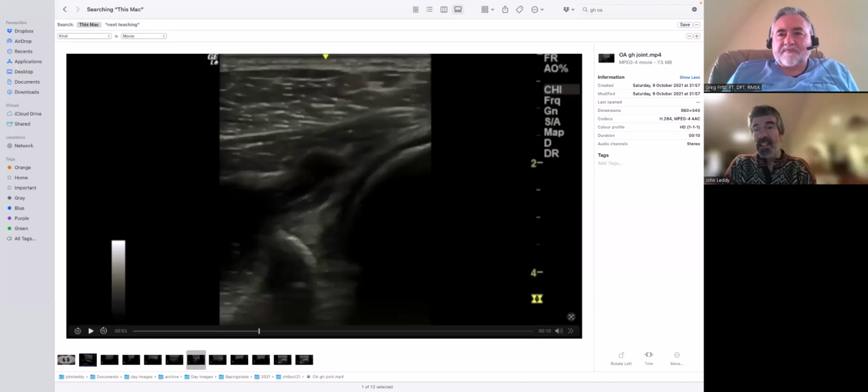In fact, it's in the younger arthritic patients, seeing a good rotator cuff, even in the older population, that's often the thing that makes me think, oh, am I going to find arthritis when I go around the corner? This patient actually has a pretty good looking rotator cuff. And I don't know whether that's just an association or there's actually a process going on there.